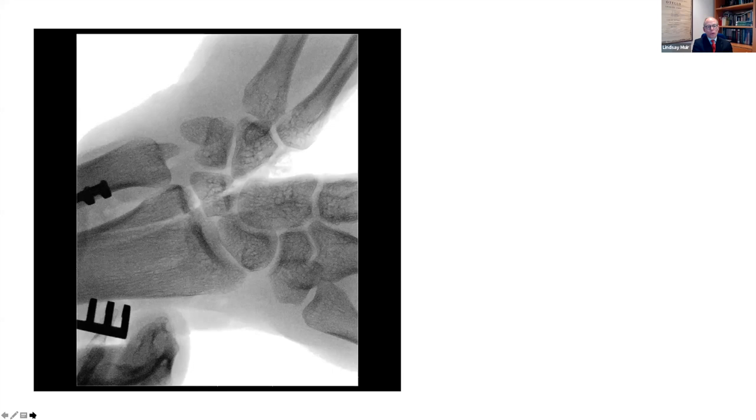Well, are there any other views, or is it just that one view? Well, I was just thinking if you could help us with what you can see there. Okay, well, it looks to me like he's put his hand up, and he's had a nice, neat incision between the capitate and the hamate, and then a nice clean bisection of the lunate, carrying on down into the radius.